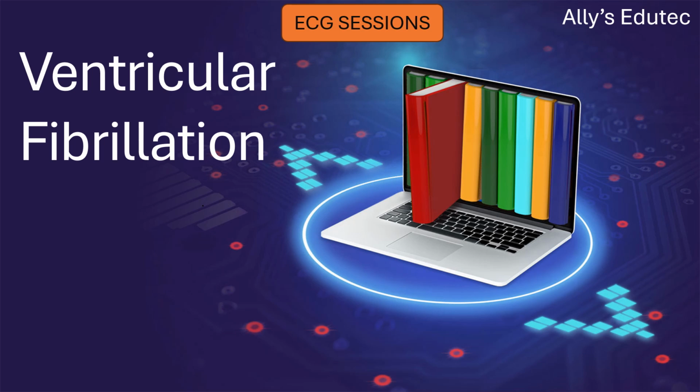Today we are going to discuss ventricular fibrillation, a shockable ECG rhythm. We'll see what ventricular fibrillation is, what it looks like, why it happens, and most important, how to respond in an emergency.